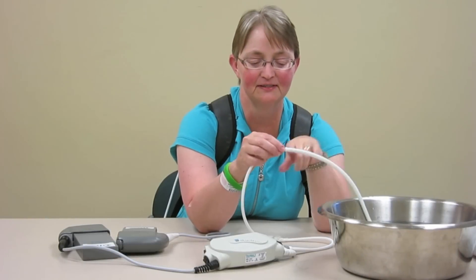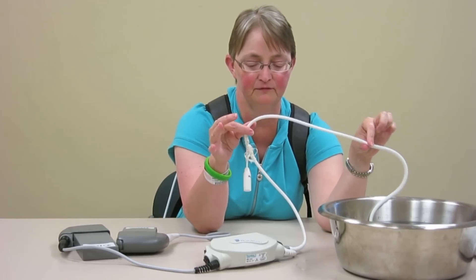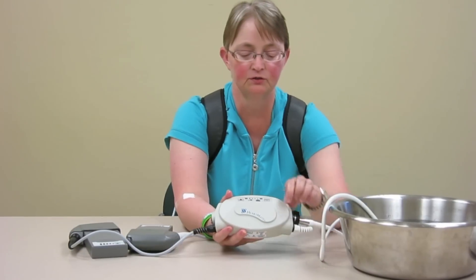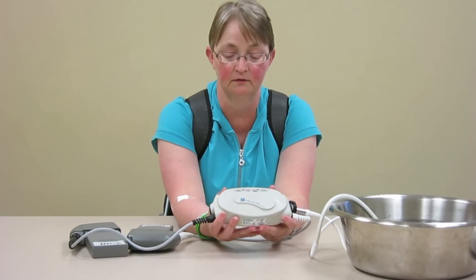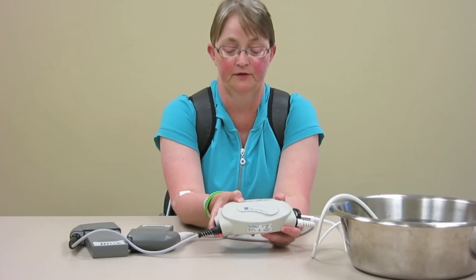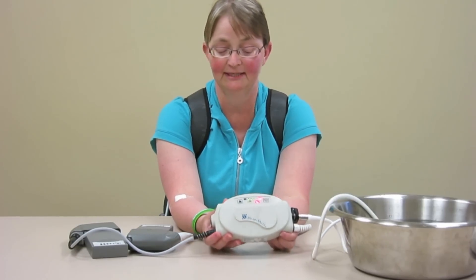The first thing that you're going to see is the driveline. That's going to be coming out of you and going into your system controller. The system controller gives you two ways of detecting if there's something wrong. There's audio clues — I'm going to run a self-test for you, just so you can hear how loud it is. Nice and loud.